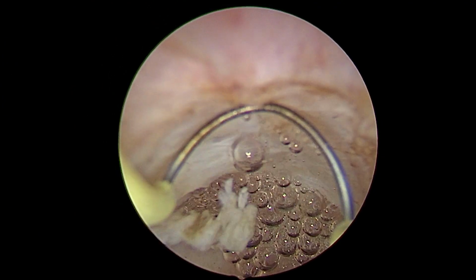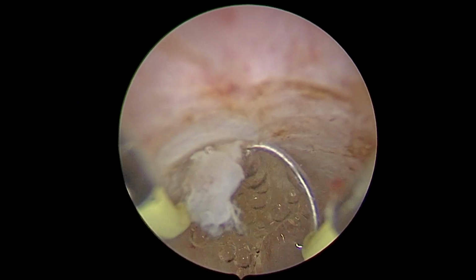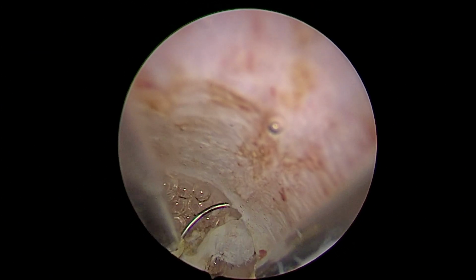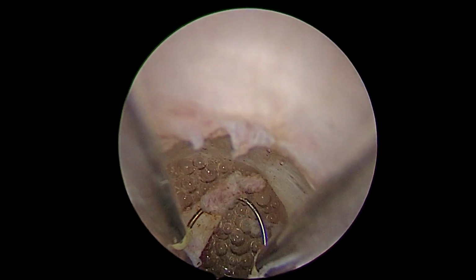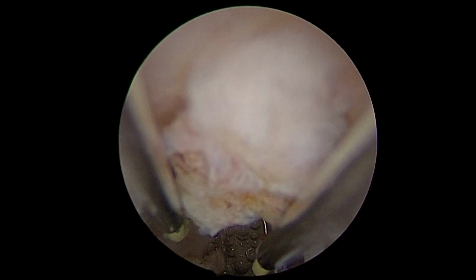Today I am going to present a case of hysteroscopic resection of isthmocele. As shown in this video, this patient was posted for IVF for embryo transfer, but because of the fluid collection in the isthmocele area, which was going up in the cavity, the hysteroscopic isthmocele correction was planned because the residual myometrial thickness was 6 millimeter.